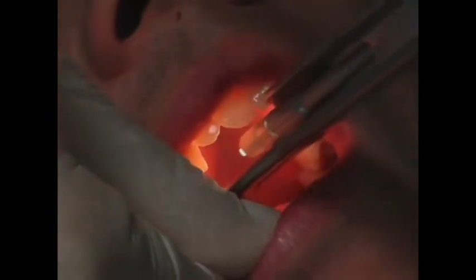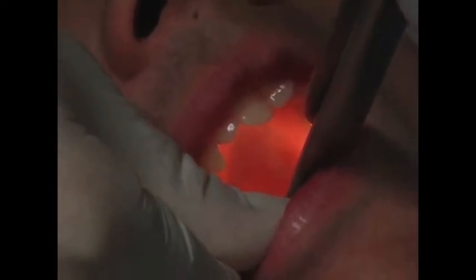The laryngoscope is inserted into the mouth and the glottic opening is visualized, which may require the use of suction to clear secretions from the posterior pharynx. First, you see the epiglottis and the introduction of the straight blade. You see it picking up the epiglottis and the vocal cords coming into view. Now you see the endotracheal tube being passed between the vocal cords so that the cuff of the tube is below the cords.